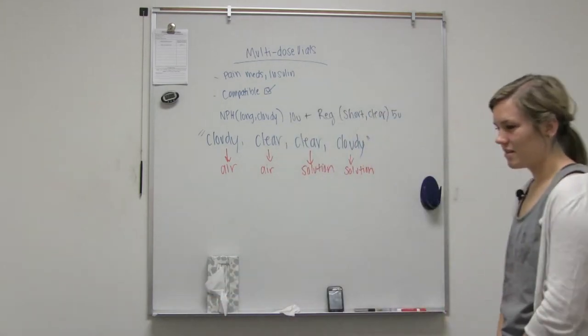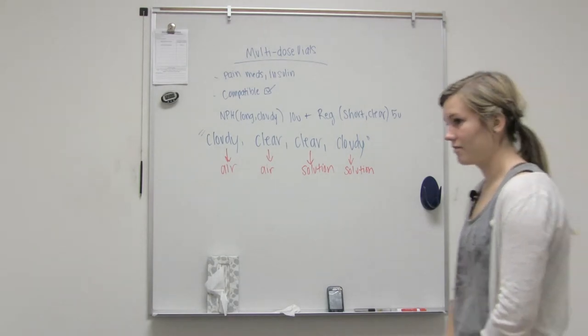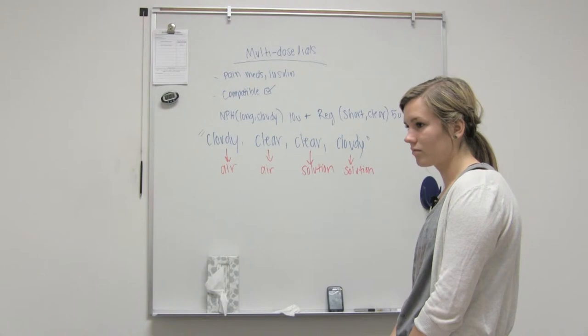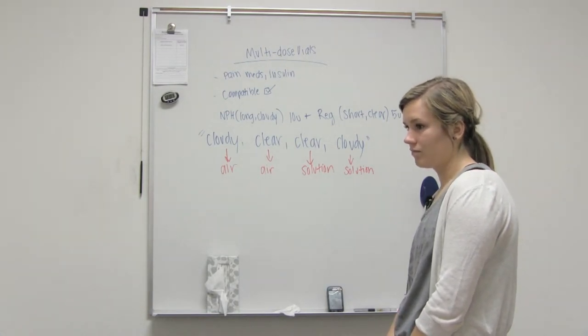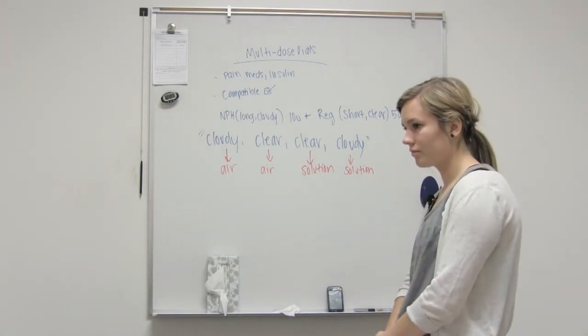Does that make sense? It'll make more sense once you physically do it. So, just to make sure I have it. You have 2 needles and then you pull up 10 units of air and put it into the cloudy solution. Then you do the same thing with the clear. You pull up 5 units. Different needle though. Different needle, and then you put in 5 units of air and then pull out 5 units of clear. And then you go get the cloudy.